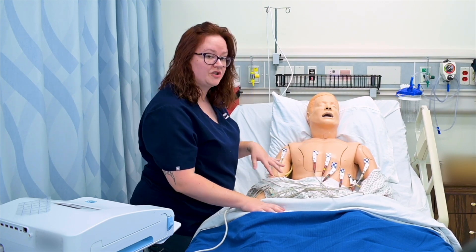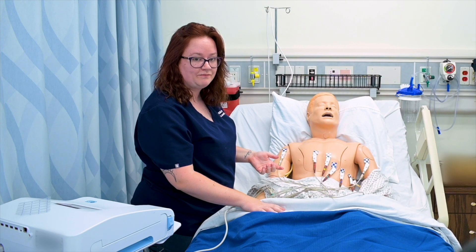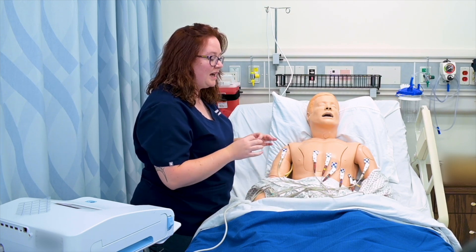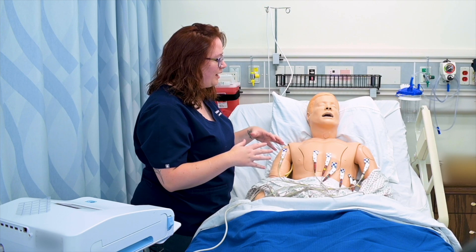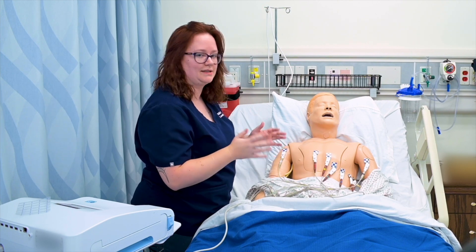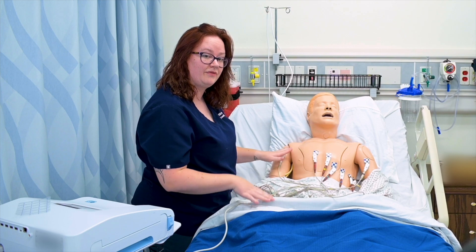If we count the electrodes, you'll notice I've only put on 10 electrodes, but we call this a 12-lead EKG. That's a really common misconception — it doesn't mean I have 12 leads. I don't actually have 12 electrodes. I have 12 images or angles that are used to examine the heart when I use this machine, but I actually only have 10 physical electrodes.